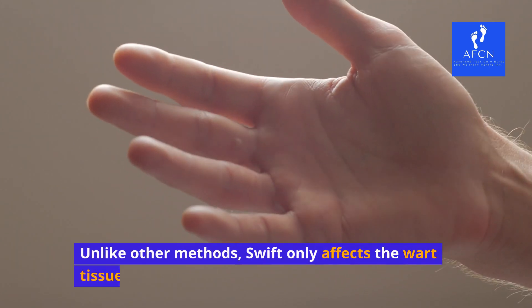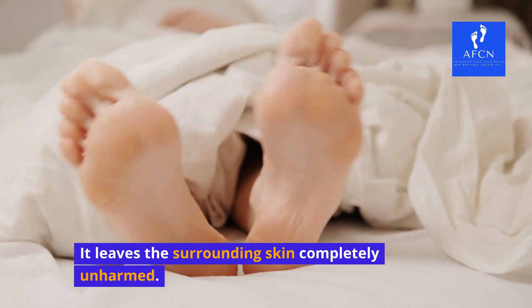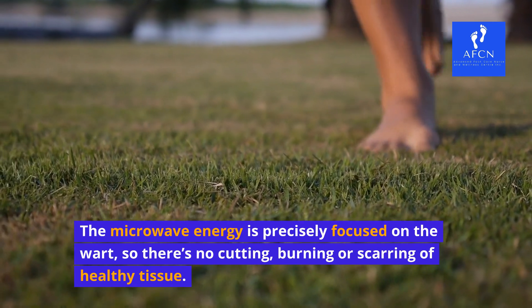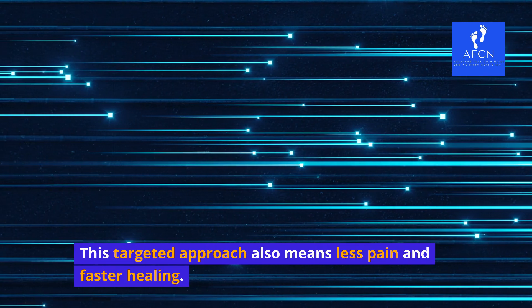Unlike other methods, Swift only affects the wart tissue — it leaves the surrounding skin completely unharmed. The microwave energy is precisely focused on the wart, so there's no cutting, burning, or scarring of healthy tissue. This targeted approach also means less pain and faster healing.